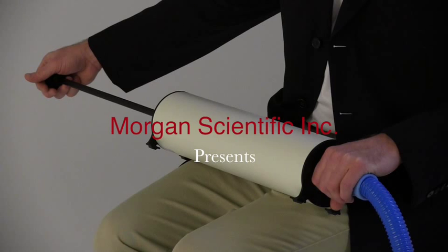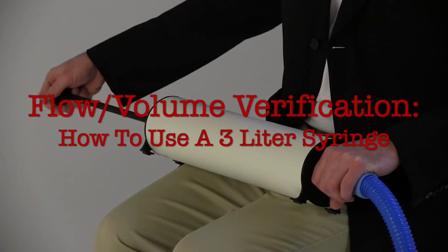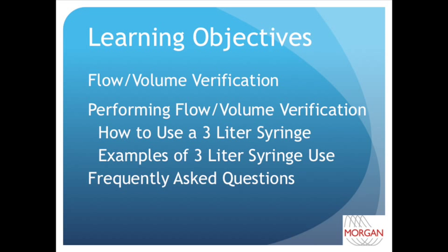Morgan Scientific Incorporated presents Flow Volume Verification: How to Use a 3-Liter Syringe. By the end of this video, you will have learned what flow volume verification is, how to perform flow volume verification using a 3-liter syringe, and what correct and incorrect 3-liter syringe use looks like.